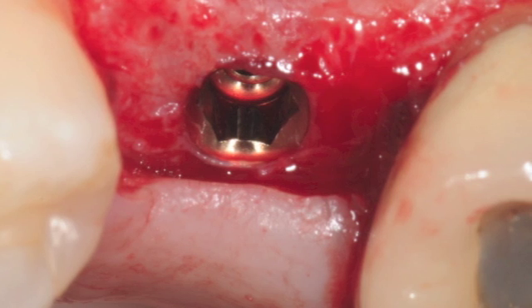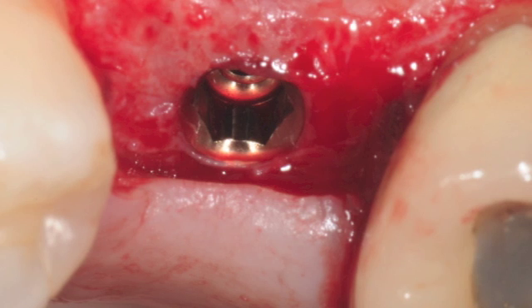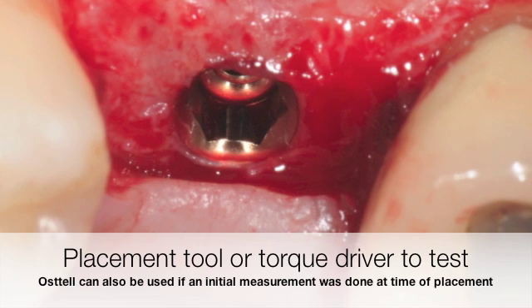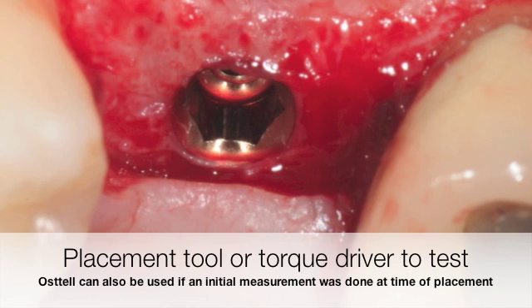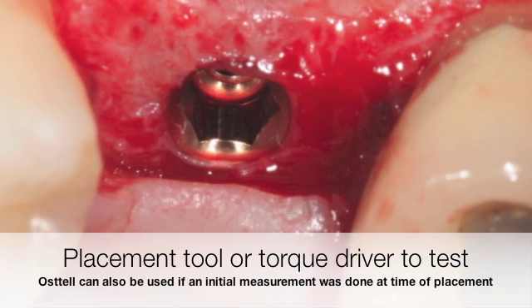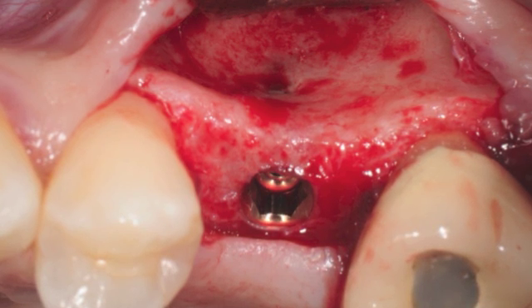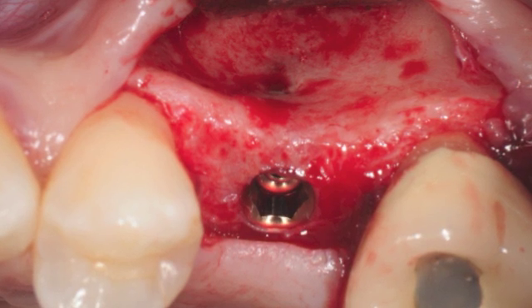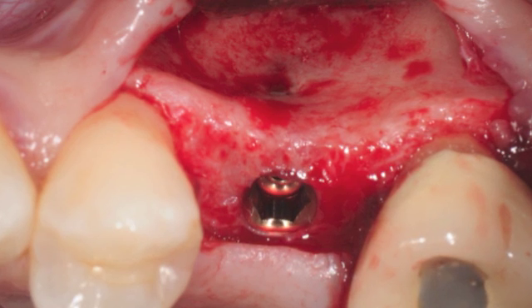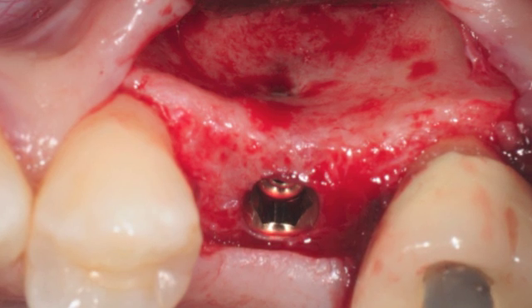For treatment, the implant was first exposed with a crestal incision and a submucoperiosteal flap. To check the integration and stability of the implant, a placement tool was inserted and the implant was attempted to rotate with a reverse torque, but it was noted to be quite stable and fully integrated. An implant with fibrous healing would have easily reversed by placement of this tool. Further exploration of the lateral wall revealed a small dehiscence of the implant, but no granulation tissue or any evidence of infection. It was located precisely where she complained of pain on palpation earlier. With this, we confirmed the diagnosis of peri-implantitis with local bony dehiscence on the lateral side.